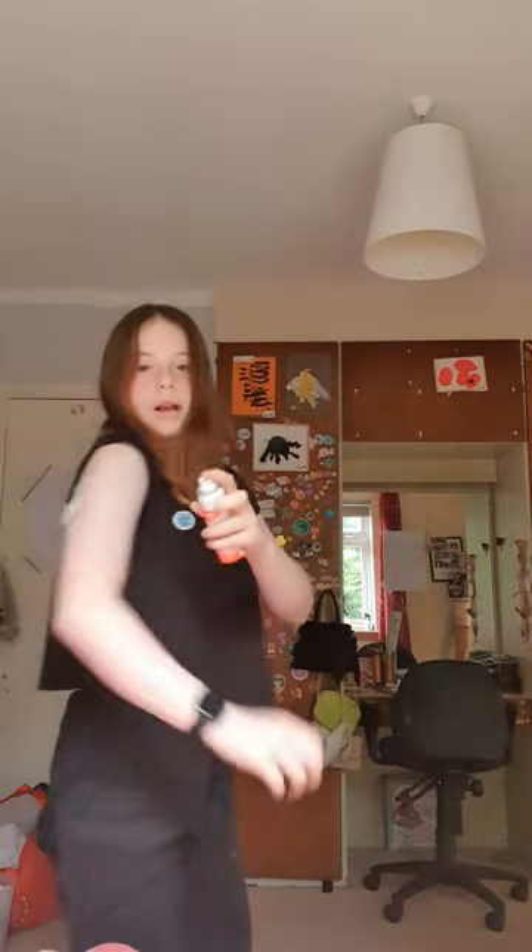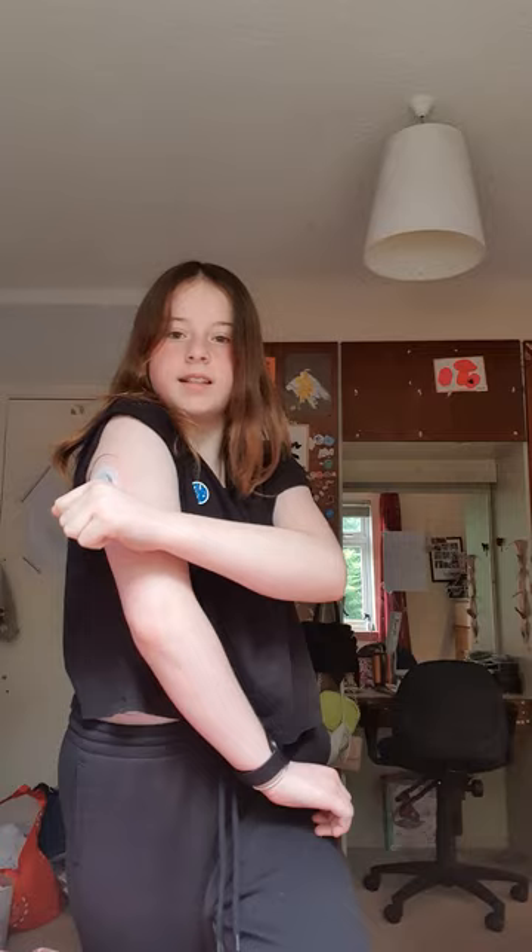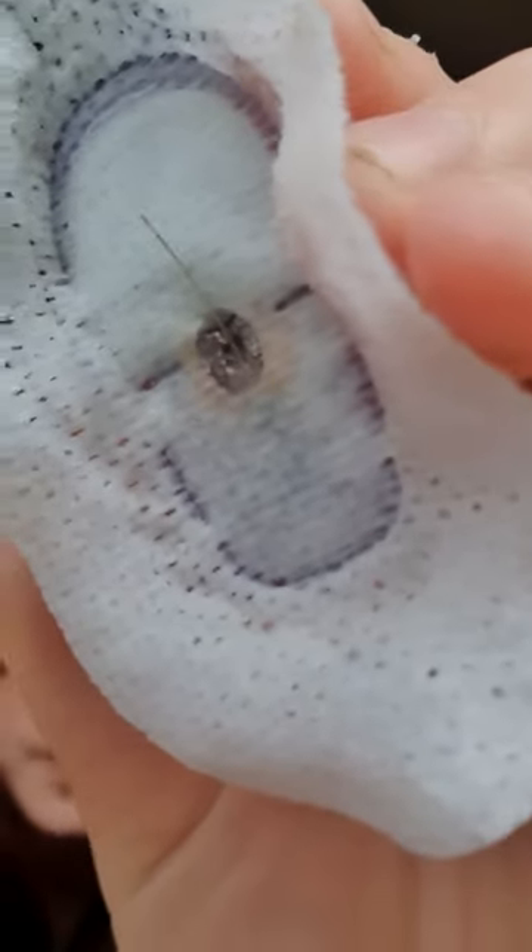Step one: I'll get my spray and go to my arm. So I sprayed it on and I'm ripping it off. As you can see it only ripped off the patch because it's done a really good job of protecting. So I'll spray it again. Do you see that brown stuff? That's dried up blood.